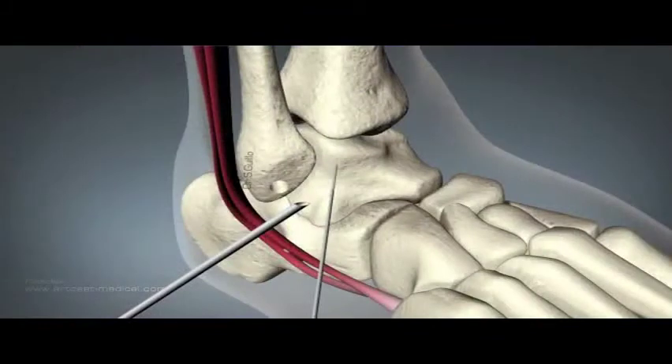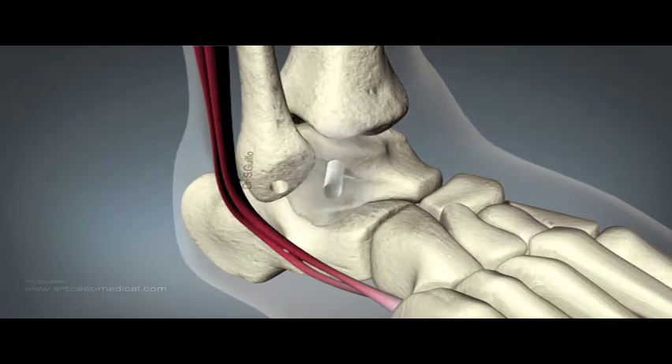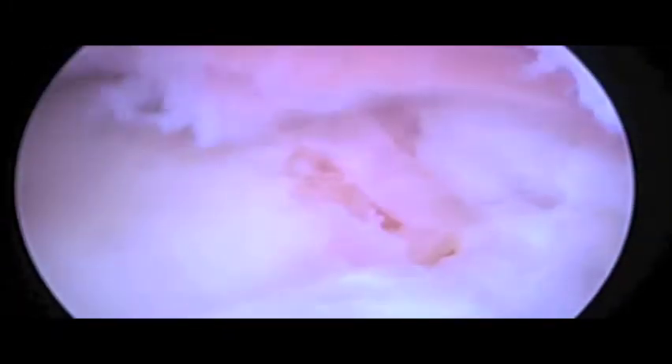Under direct vision from the inferior portal, a guide wire and subsequent drill are placed percutaneously on the ATFL insertion and passed posteriorly into the talar body. The video shows the junction of the talar body and neck. The edge of the cartilage represents the ATFL talar insertion. The guide wire and drill are passed under direct vision and the tunnel can be clearly seen.